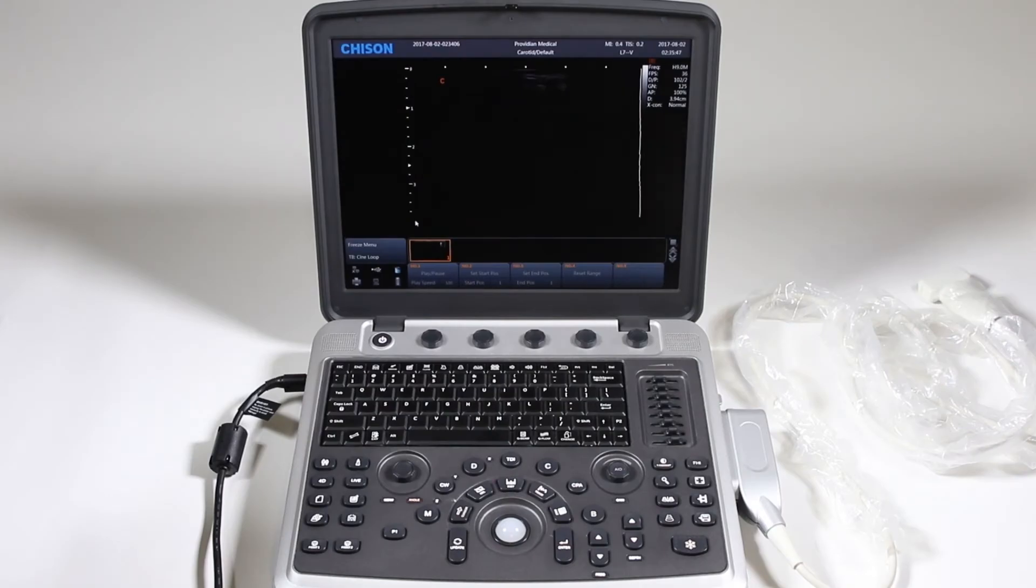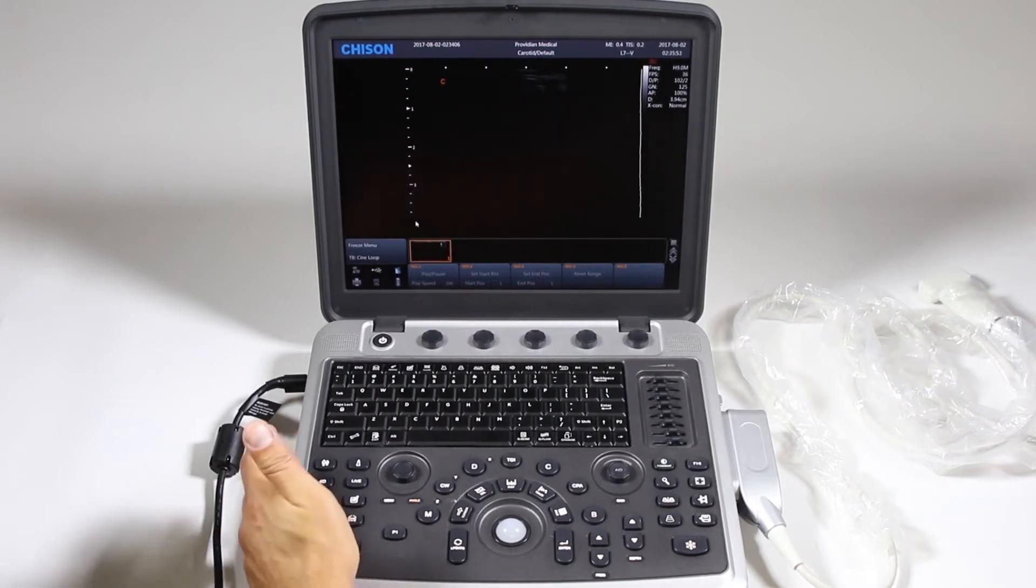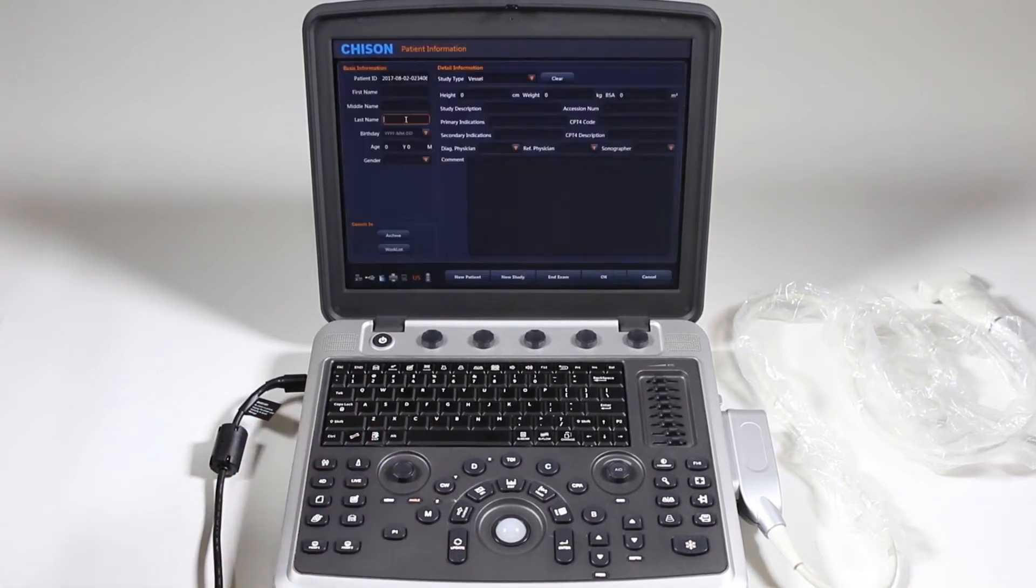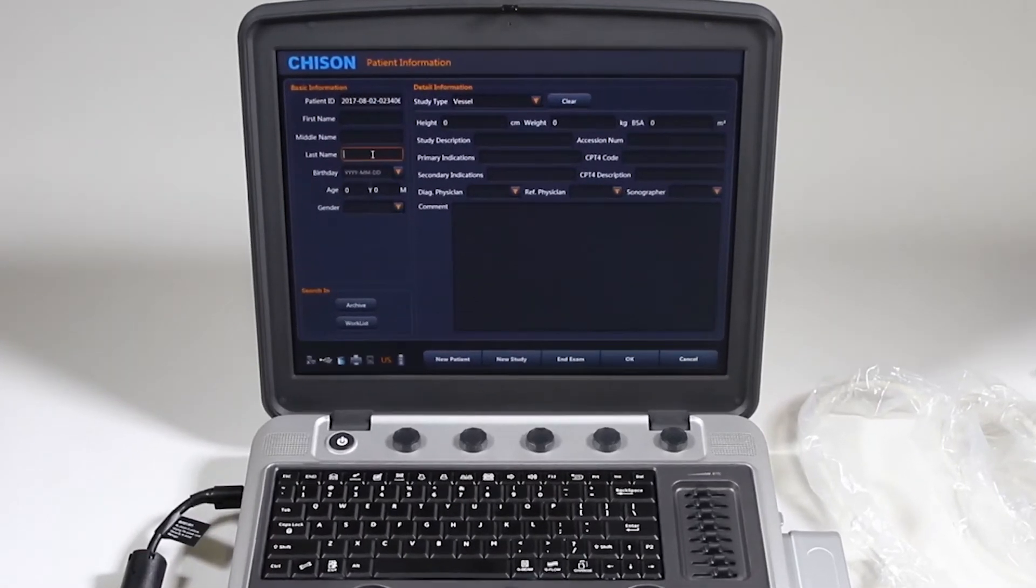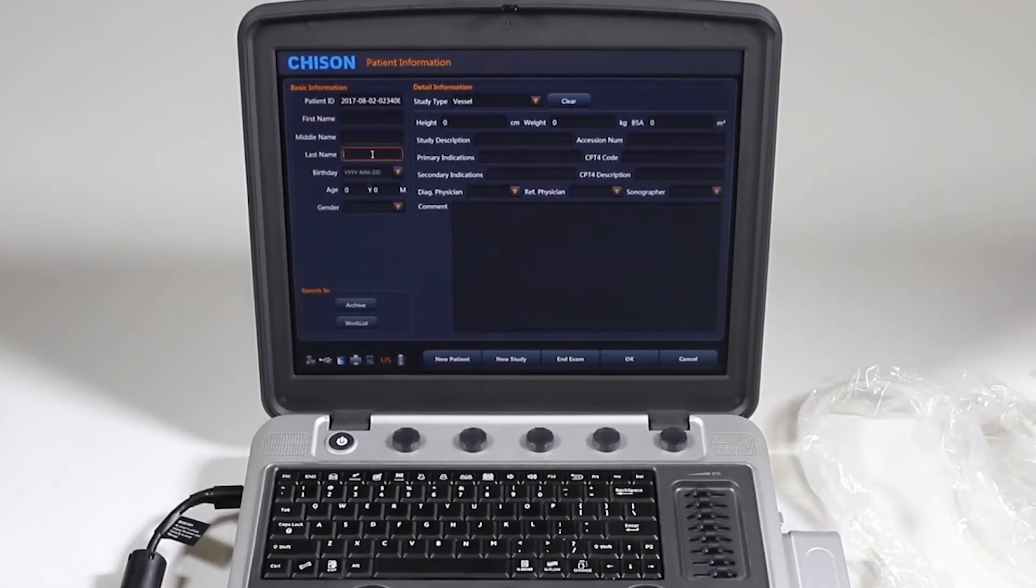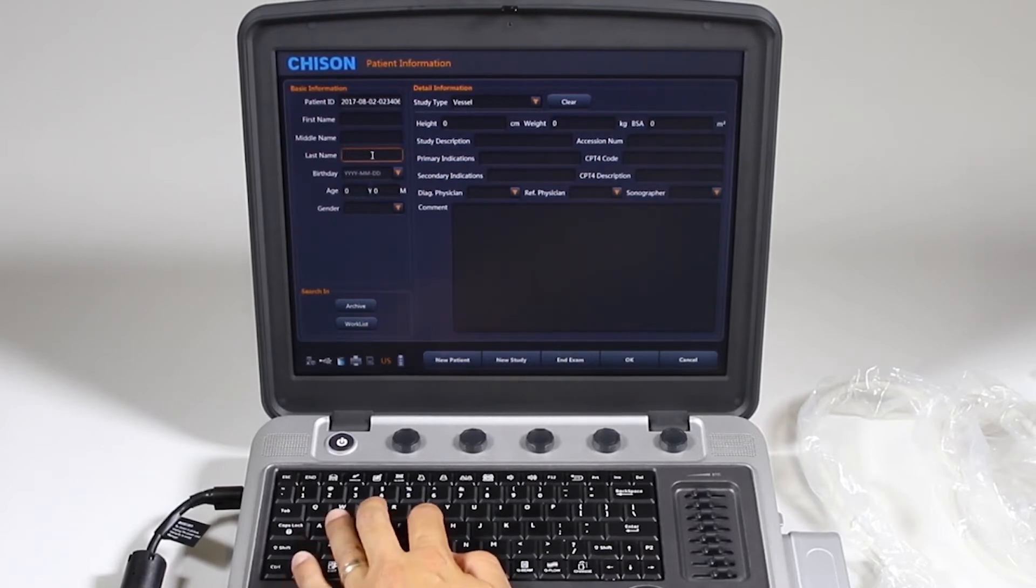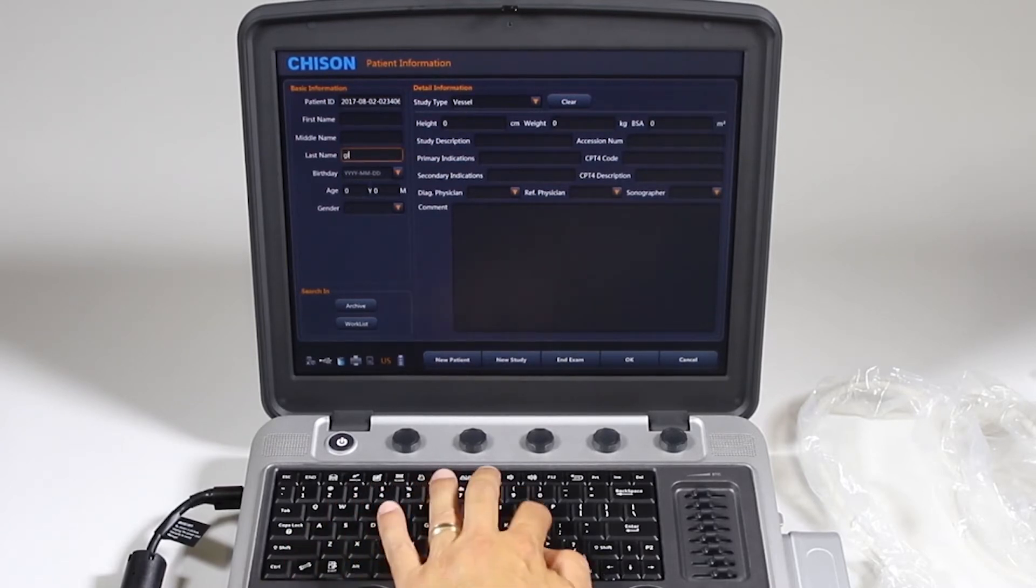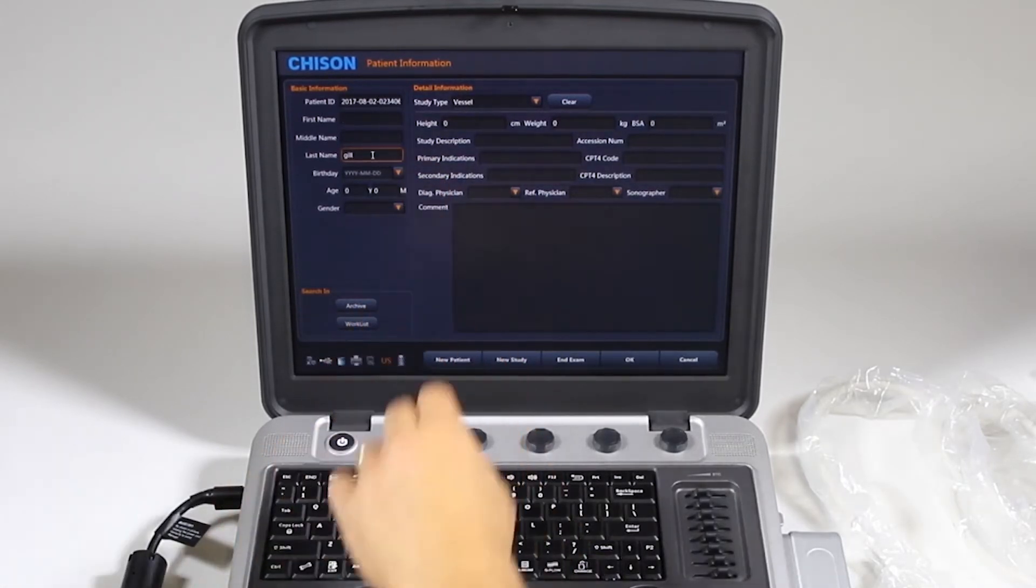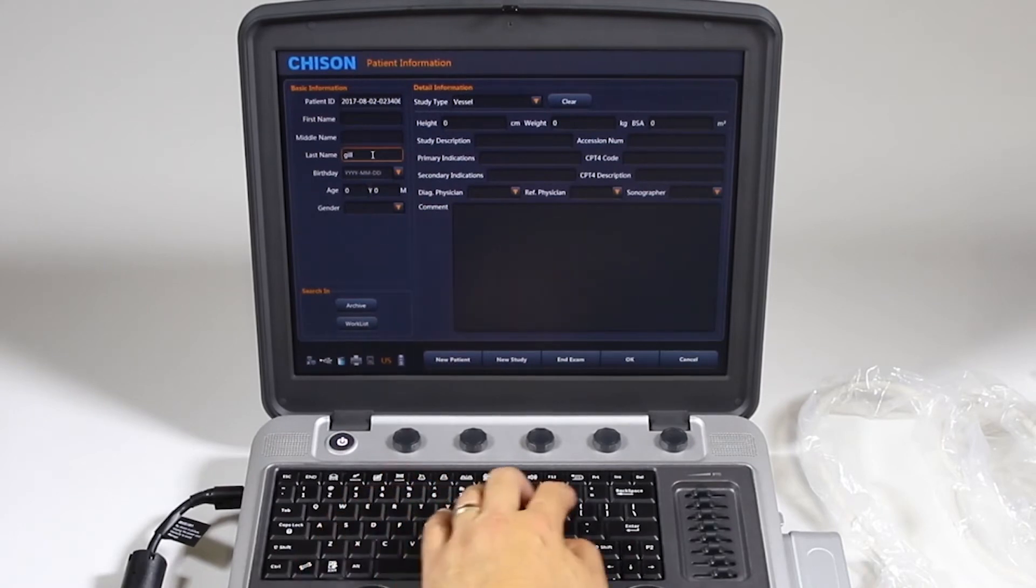For general imaging and image optimization controls, we'll just get started here. We'll start by adding a patient by clicking our new patient button here. Now note it starts on last name. Your machine may be different depending on your software level, but you would just type in the last name and you can tab and it will go back up to the first name.